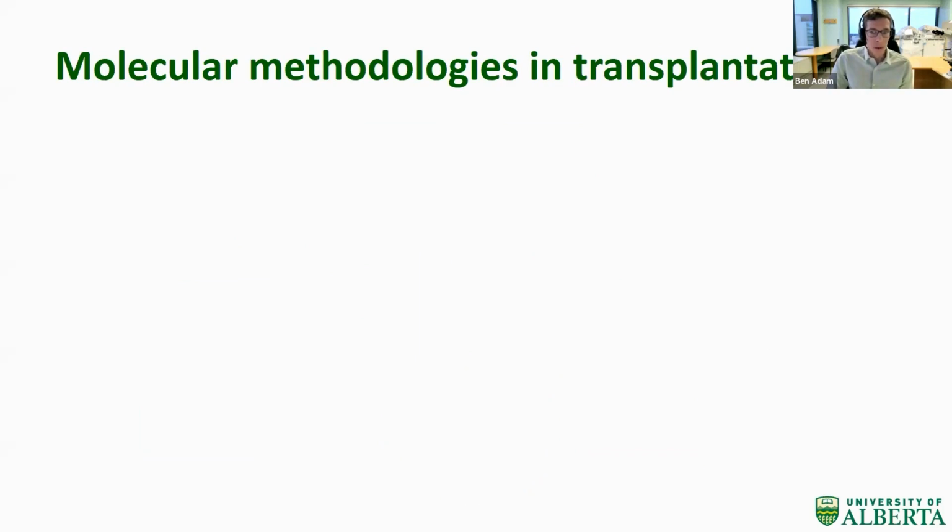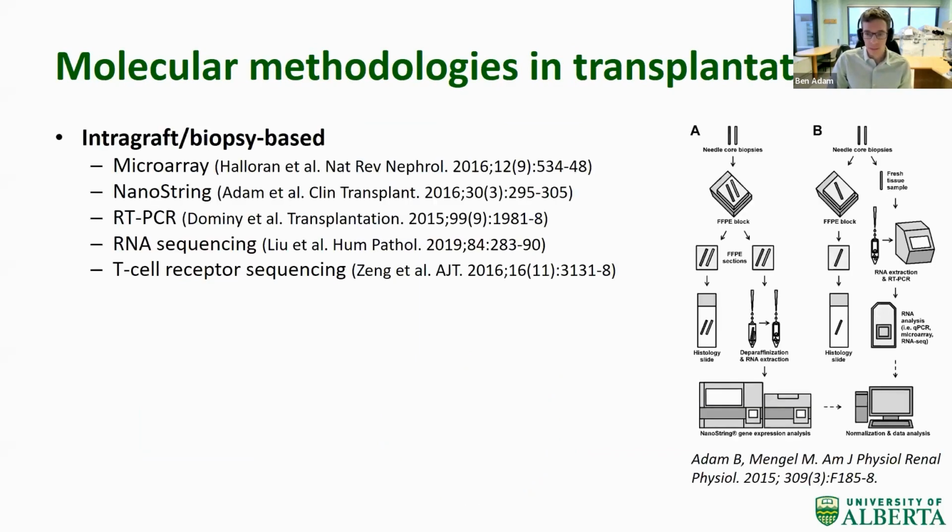Okay, so what molecular methodologies are currently available to us in the field of transplantation? With regards to intragraft or biopsy-based tools, the primary modalities include cDNA microarrays or gene chips, which I would consider to be the most firmly established in the field, NanoString, which will be the focus of most of my talk, and then other gene expression technologies like RT-PCR and RNA-seq.